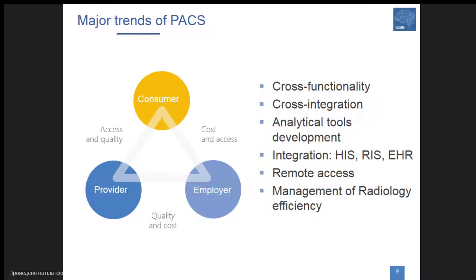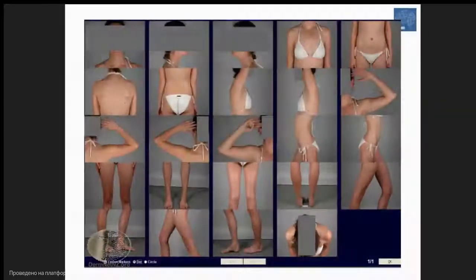The parties, or stakeholders, interested in the PACS are the patient or consumer, the provider as a radiologist, and the employer as a hospital. All of them in this triangle are interested in having a reliable PACS which helps to manage workflow. And it also should have, of course, remote access, and we shall talk a bit about efficiency.